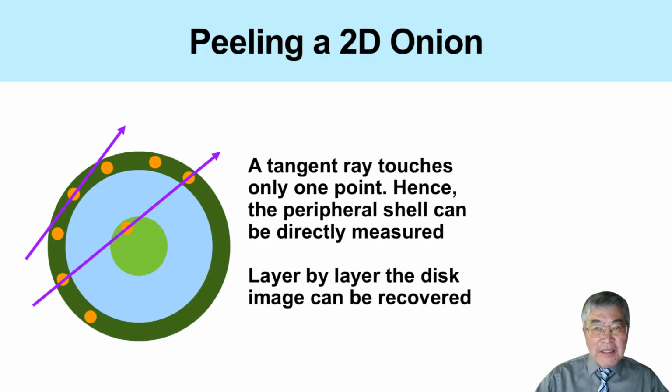Of course, this is a heuristic explanation rather than a practical reconstruction algorithm. But it gives us an important intuition. With enough projection data from suitable directions, the internal image information is encoded in the measured X-ray data. In this sense, CT reconstruction can be understood as progressively recovering the hidden structure of the object from its line integral measurements.